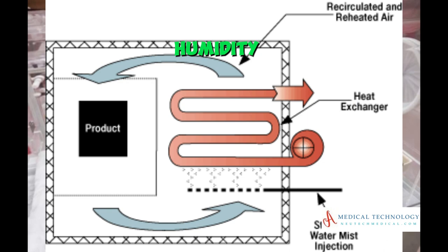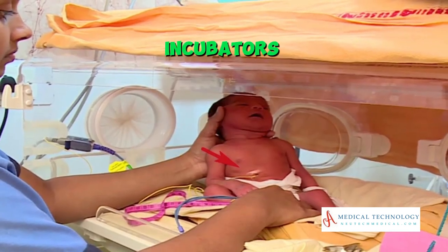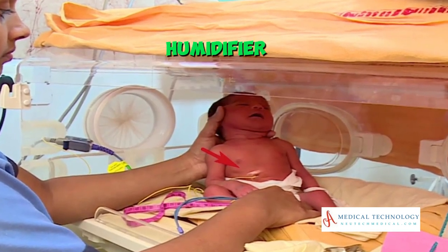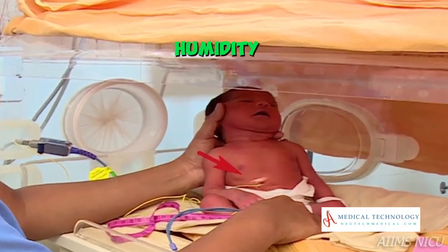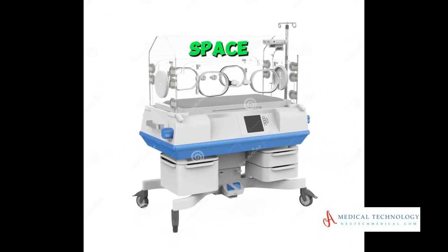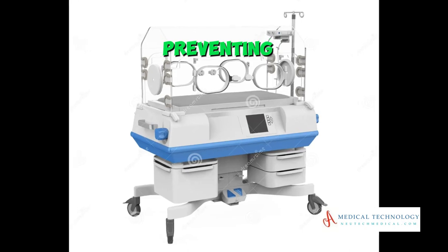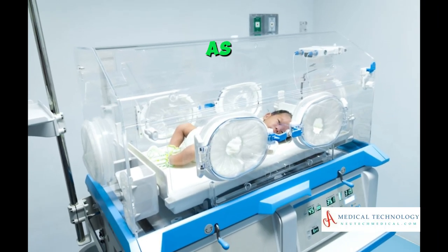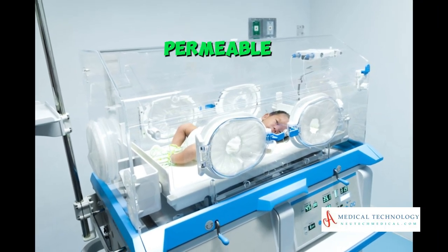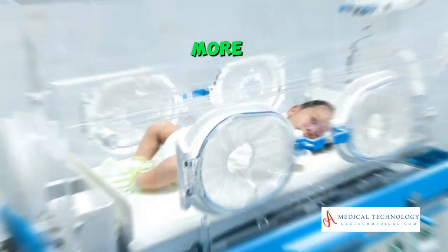Humidity control — humidifier. Many incubators include a humidifier to regulate humidity levels within the enclosed space. This is crucial for preventing dehydration in preemies, as their skin is more permeable and they can lose moisture more easily.